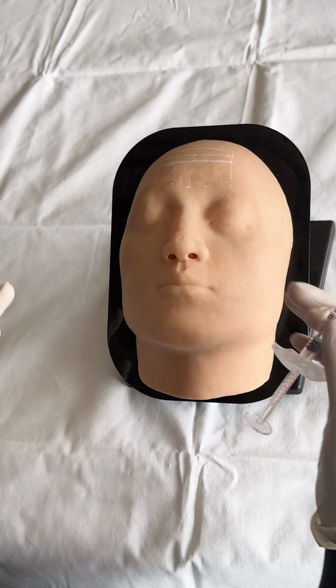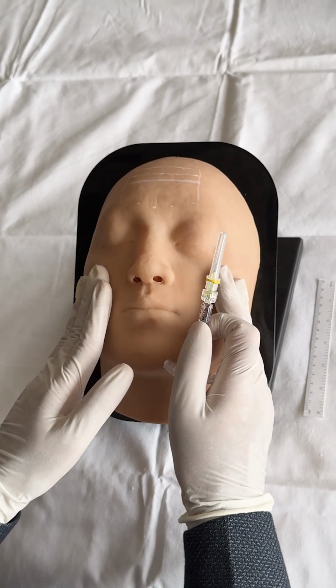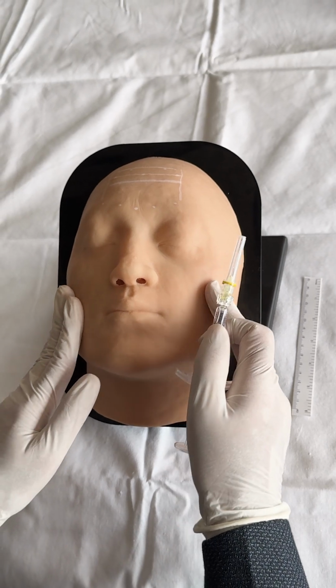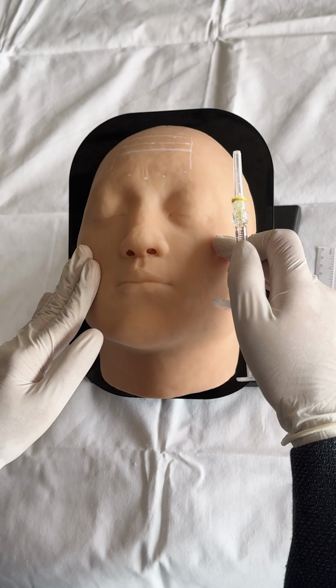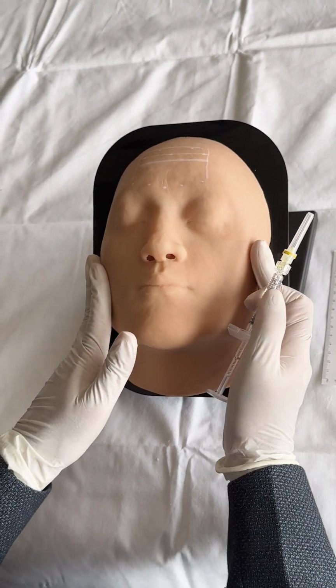Let's see another procedure to perform fillers on FaceSim model. The depth of the fillers is always much deeper as compared to the botulinum toxin, and we have to go inside the subcutaneous tissue, hit the bone, slightly retract, and then do the injections at various filler points.